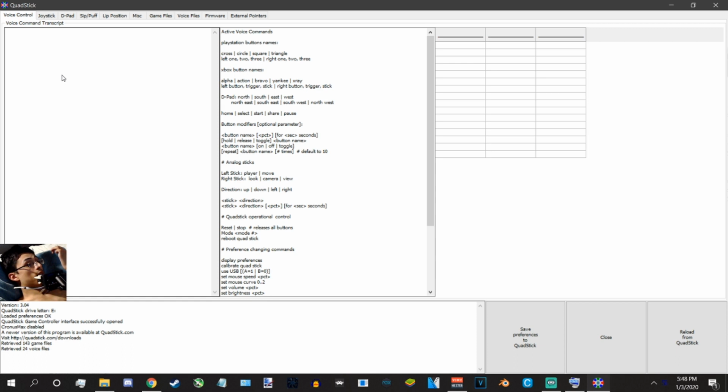I've noticed a lot of people have made tutorials on the Quadstick as well, and that is fantastic. They may be able to explain better than me, or even things I missed because there's so much here. But if you first get the Quadstick, it's very important to download the Quadstick Manager program. If you do not have access to the Quadstick Manager program, like you own a Mac, I will make another video explaining how to work around it. But this video would still be useful to them because they'll know what they want to adjust.